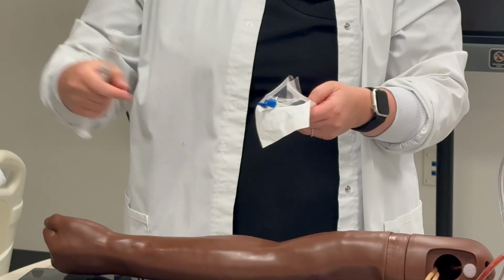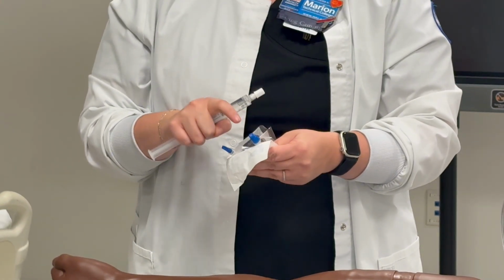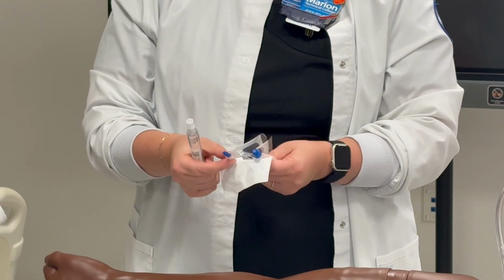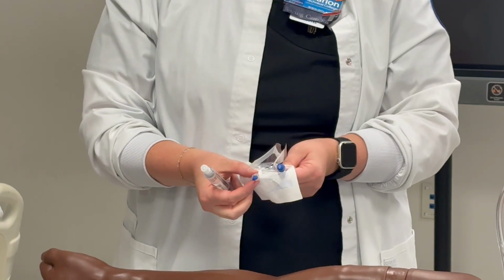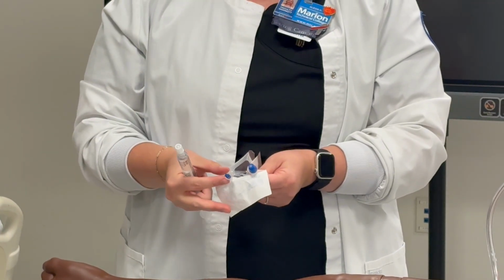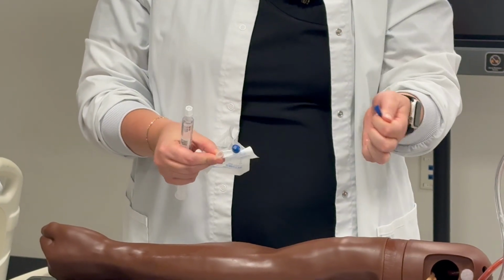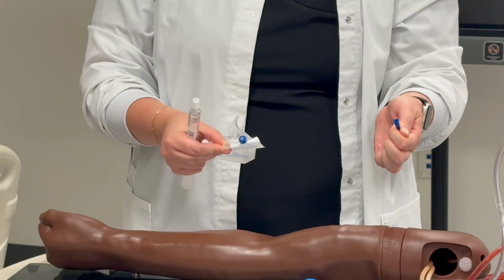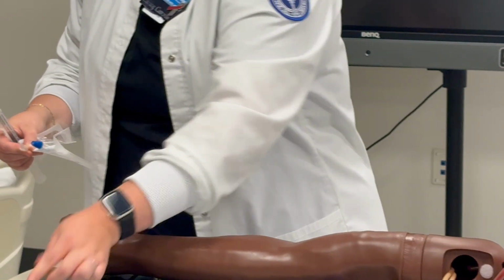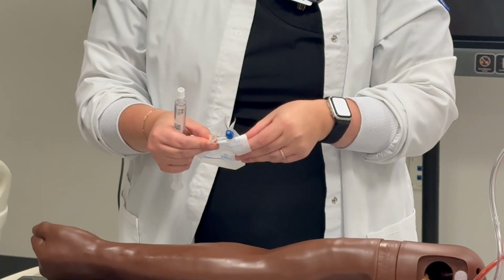So when you open this, and through the checkoff, I'll be checking this, you do not want to touch this end with your hand, and then this end is the end that hooks to the IV itself. You don't want to be touching this either, okay? So what you're going to do is remove this cap. Now it's completely open, so you cannot touch it, okay? You're going to keep that because you're going to need it to practice with, but keep that.